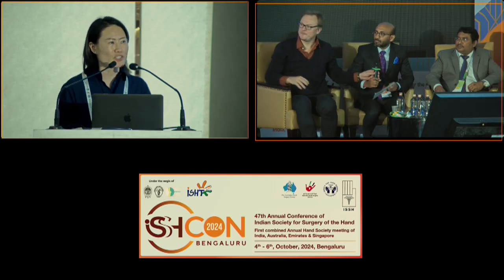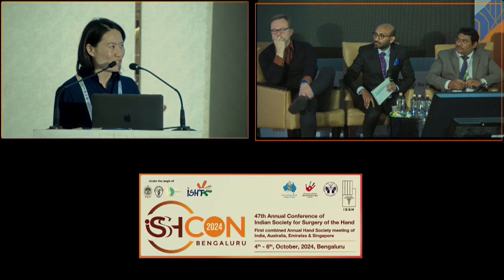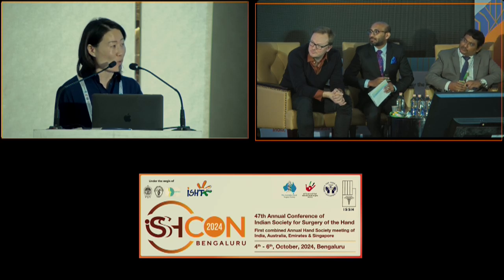So that's why when you actually drill the bone tunnels, you have to make sure that your bone tunnel is centered, about 3 millimeters away from the scapholunate joint, and really slow drill. Slow drill and just keep flushing with water and saline. Generally it is quite safe, but then again, my numbers are quite low, n equals few. So for now, the outcomes have been quite good.